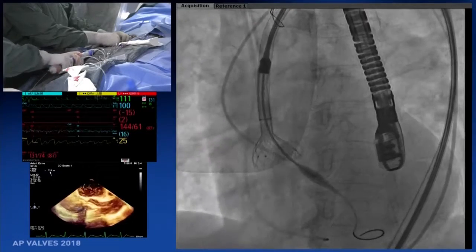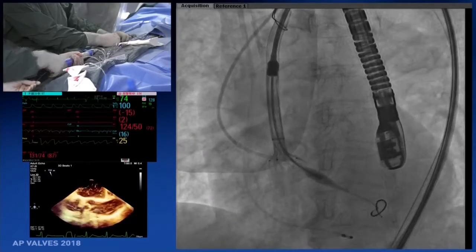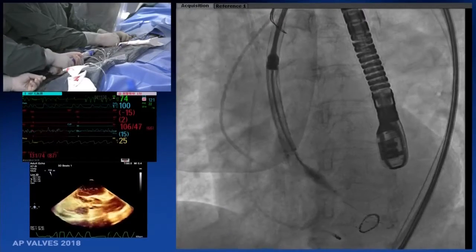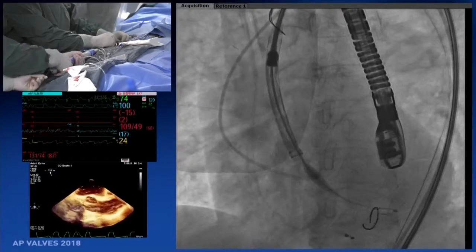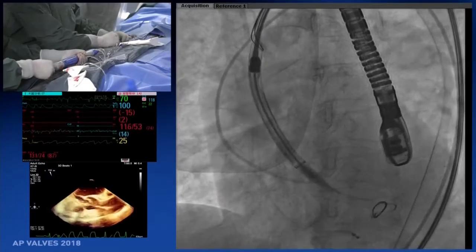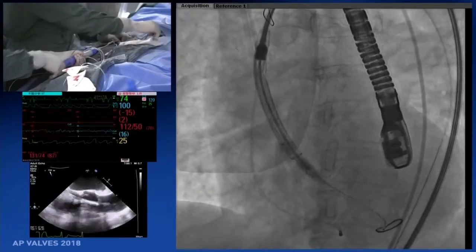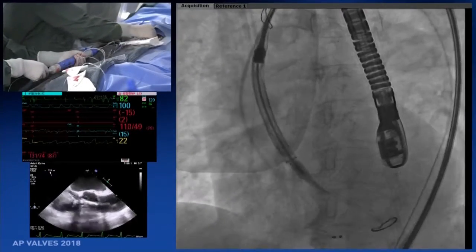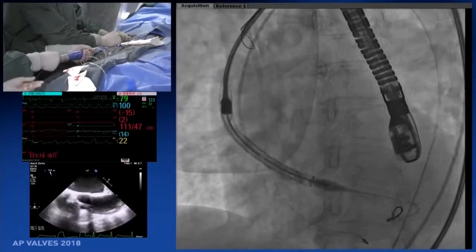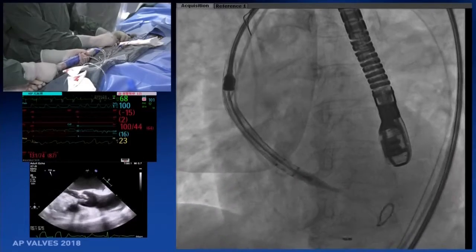Your curvature is too high, so it comes back. Probably has to start a little bit lower. The wire needs to be adjusted, it's too high. Careful with the wire. Let it settle, shall we go in again? Wait a moment. Yeah, because due to the bend of the valve, there's a tendency of moving up. It's really a very difficult situation. Now this is a better position. Yeah, stay there.